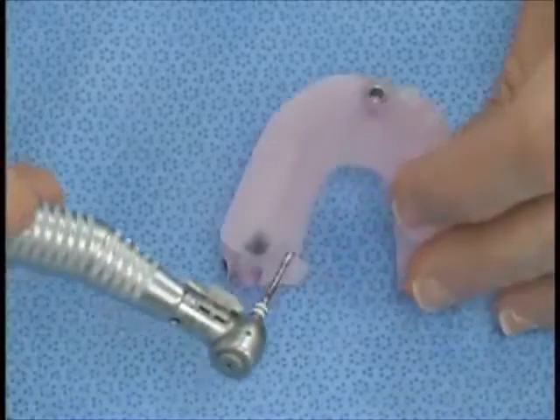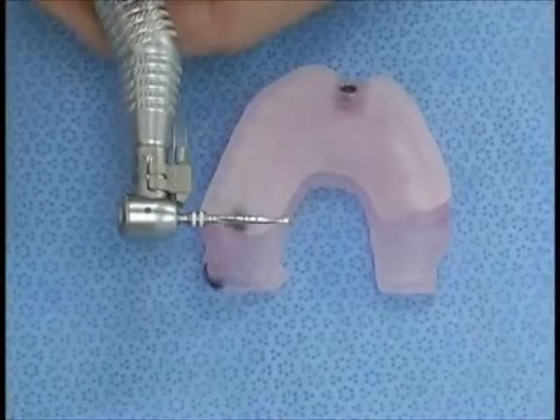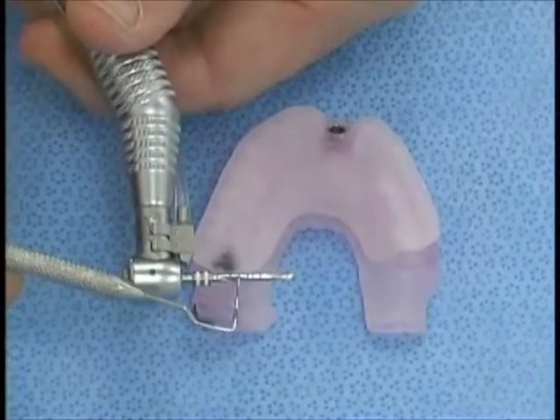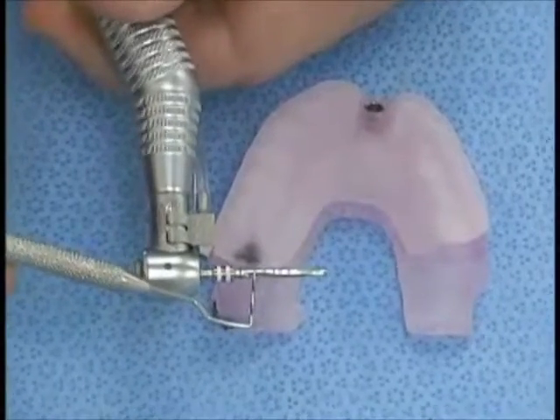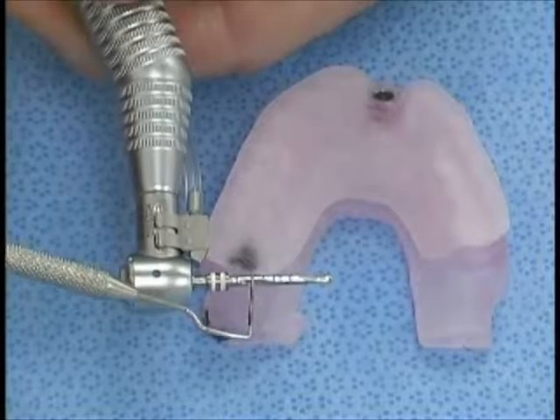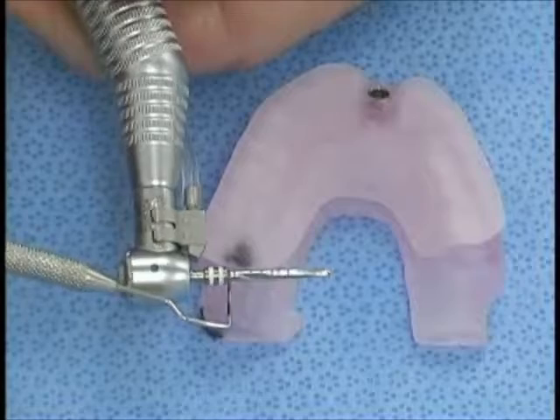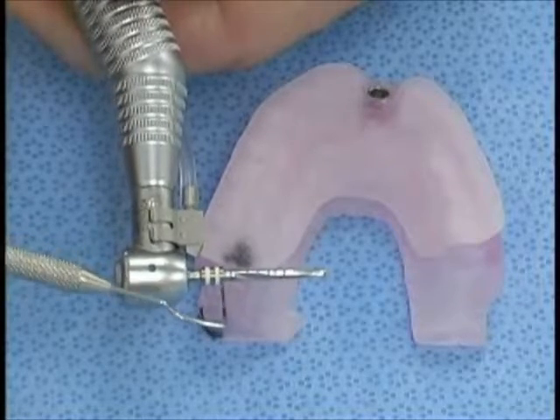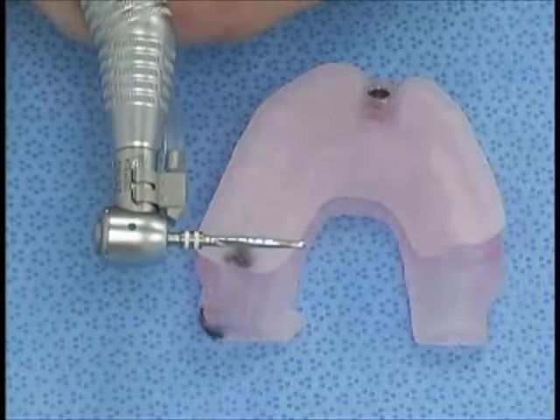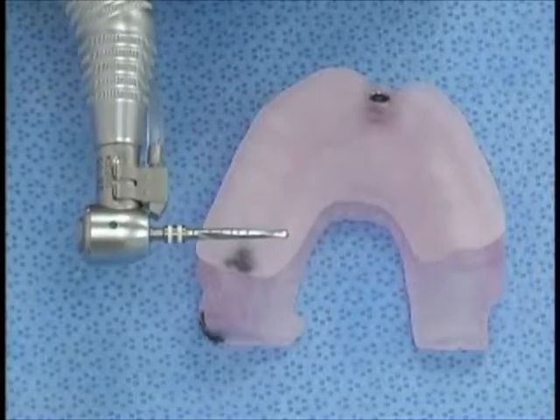So in essence, when we're looking at the drill bit over here, we're looking at 13 millimeters being right here. We add another couple of millimeters for the transgingival component, maybe up to 16 millimeters. And so we really have to go all the way to the hub at minimum in order to prepare our site. And we can, of course, deepen it further without the stent in place.